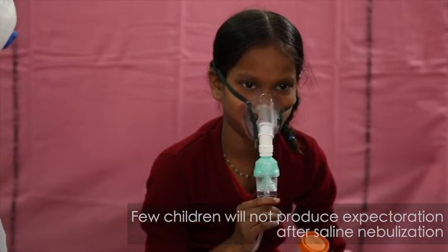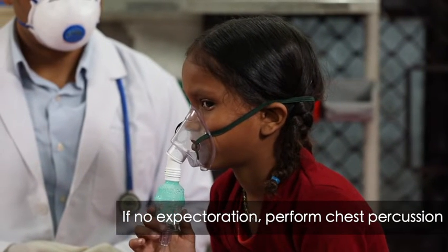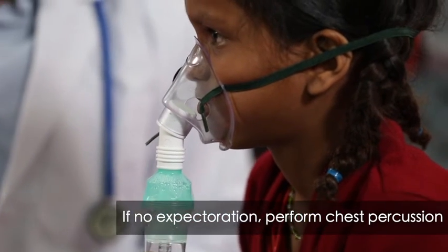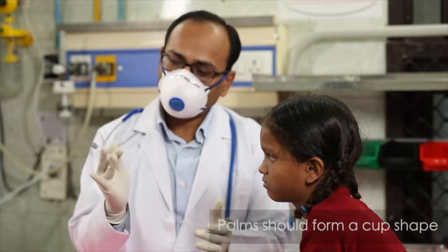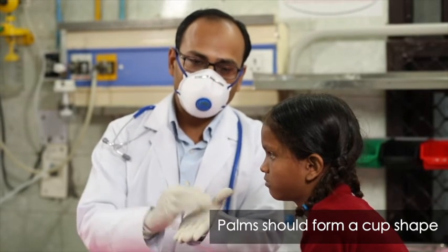Some children will only produce saliva or no expectoration on their own after 3% hypertonic saline nebulization. In such situations, one can loosen secretions and assist the child by performing chest percussion. The purpose of chest percussion is to bring secretions from peripheral to central areas, from where the child can cough them out.